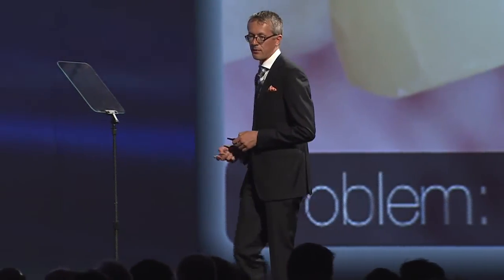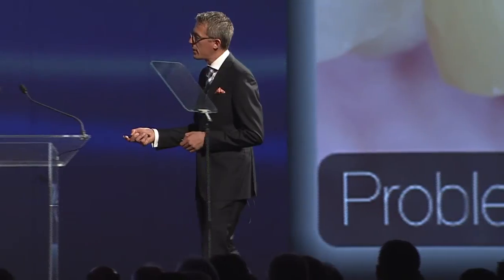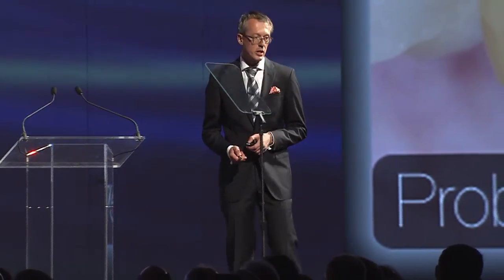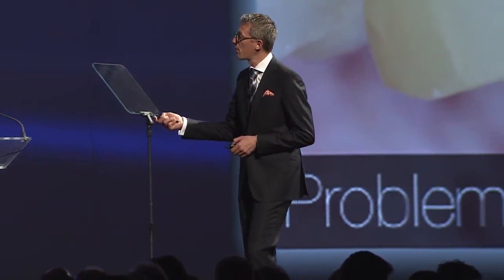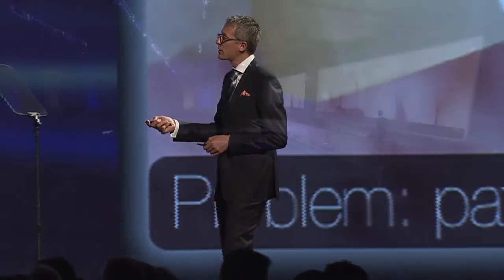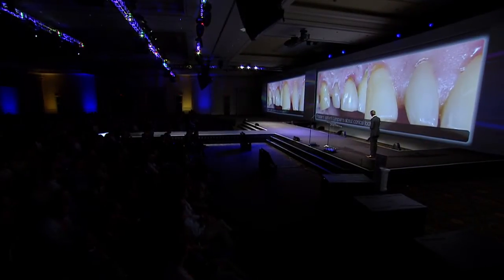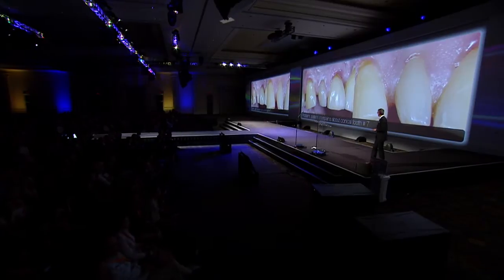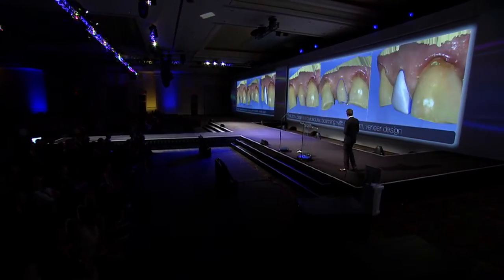Another case, this was the problem. The patient complained about the conical tooth here, about the shape. He has some additional problems. He should clean his teeth more carefully. But his main problem here was to get a bigger tooth. Okay? And so the solution was a veneer.